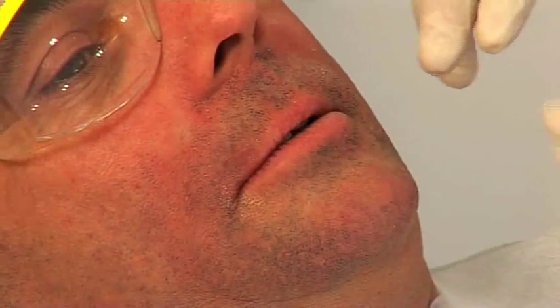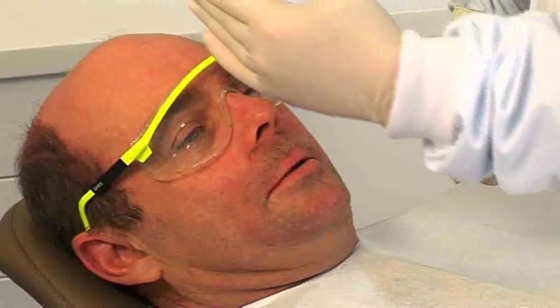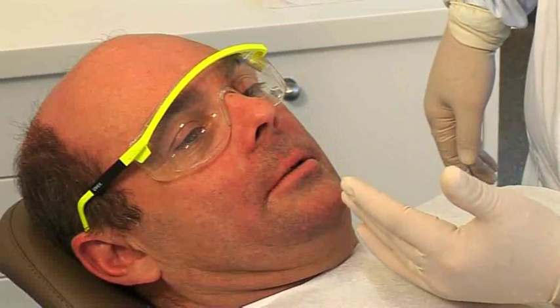I'm going to take a minute now to explain to Simon how I want him to move his jaws. The features we need to look at are that when we're using the George Gauge, the midline of the George Gauge has a mark on it and that should be congruent with the skeletal midline.